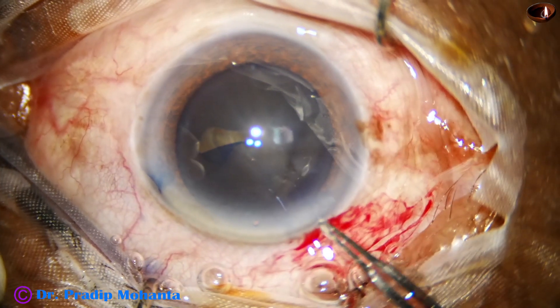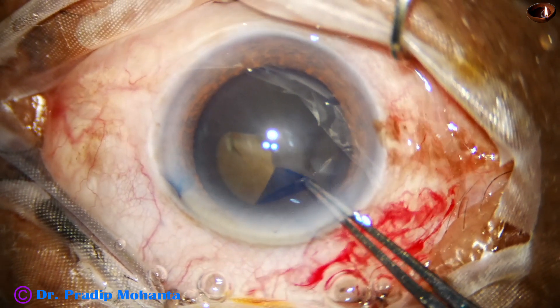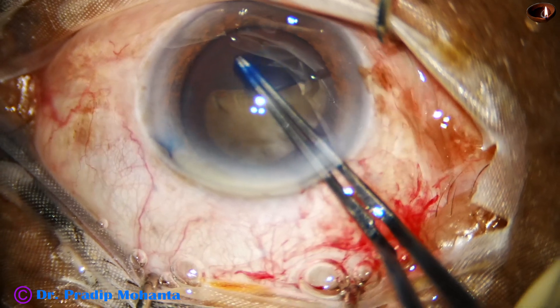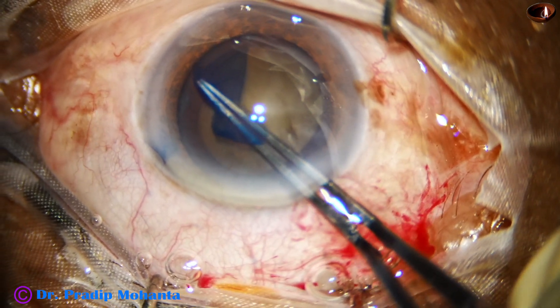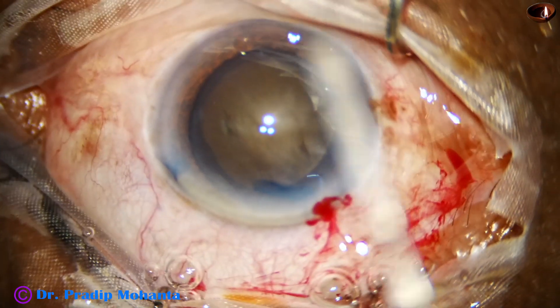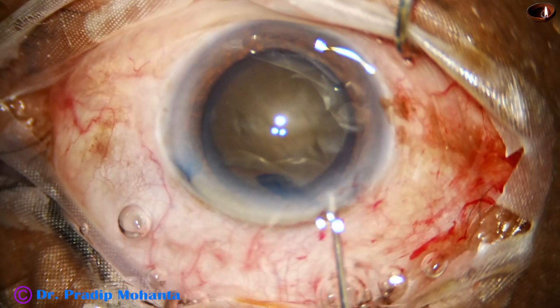And then, I use the utrata forceps again. My plan is to get an adequate size rhexis. In such hard cataracts with grade 5 nuclear sclerosis, we should deliberately do a large rhexis. Even a 6 millimeter rhexis is okay. So, we have done a large rhexis.